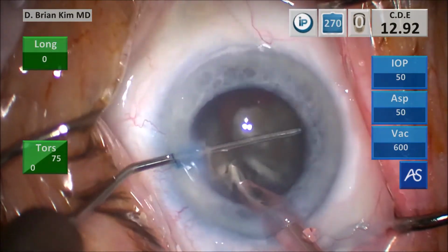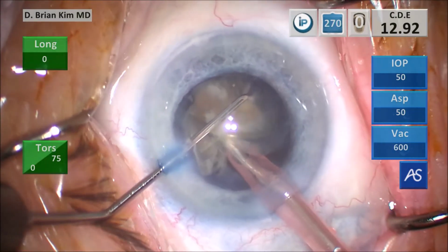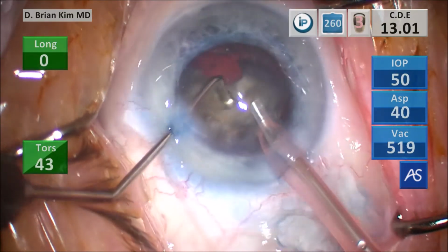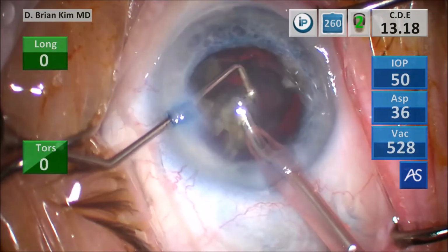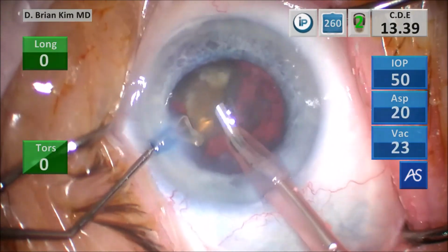Doing the same maneuver around that fragment, see the lens is turning, but it doesn't matter, it's no big deal. I'm able to hook the peripheral lens, crush it against the phaco tip once again, making sure that the pieces are completely separated, and then using some vacuum to grab that fragment, getting around it with a chopper, crushing it into smaller pieces, and then emulsifying the lens piece.